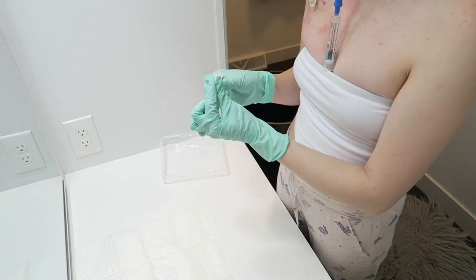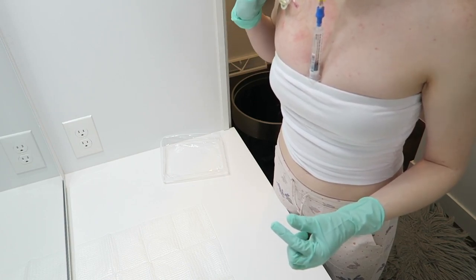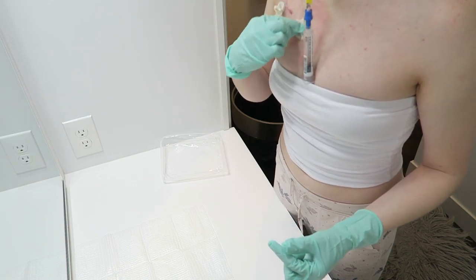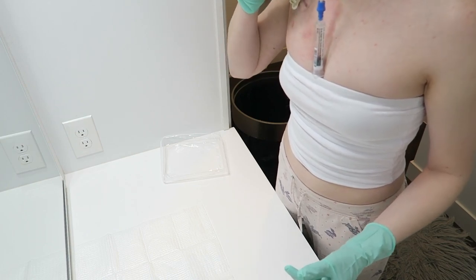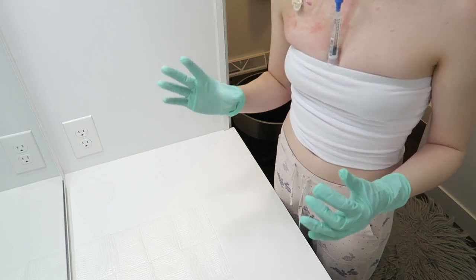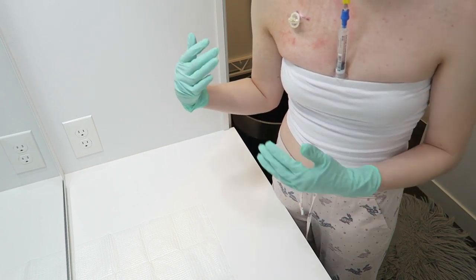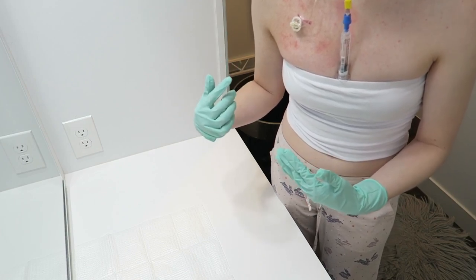So now I'm going to take the skin protector and rub it all over where the bandage is going to be. But you never want to put this underneath where the needle is because you don't want that under the needle. So you just rub it all over the area until it becomes sticky, and then that just basically means you can throw it away. All right, so now you're gonna wait until your gloves stop being sticky, because that means that the skin barrier that you just put on your skin is dry.